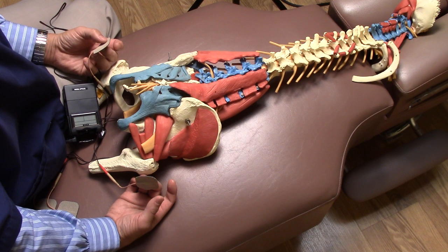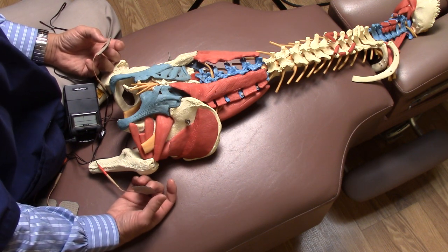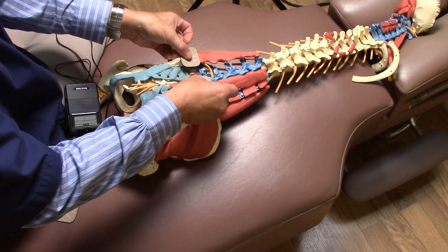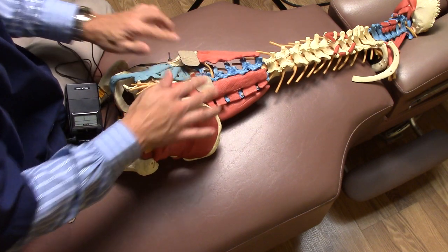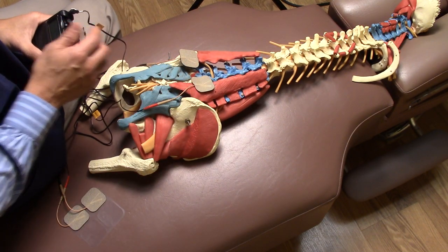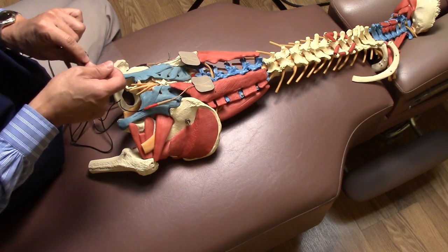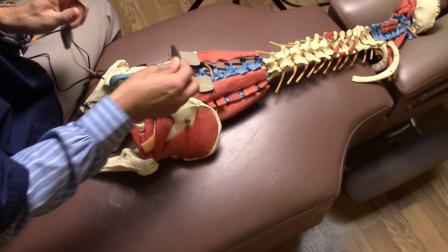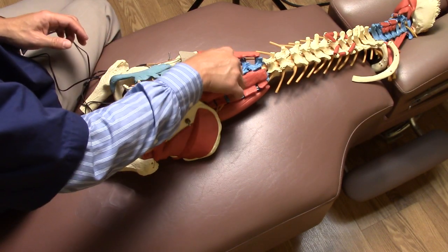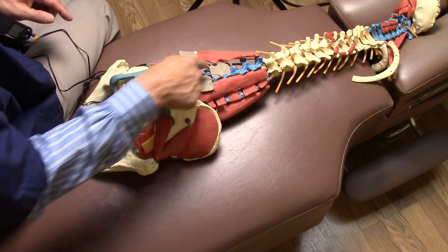If you know you have a bulging or herniated disc in your lumbar spine and you know the side where it's bulging, you can try putting electrodes on either side of that area. Turn it on, try it for a couple of minutes, and see what it does for you. Optionally, you could take the other set on the second channel and place it above and below so that you've got a cross pattern going over the painful area.